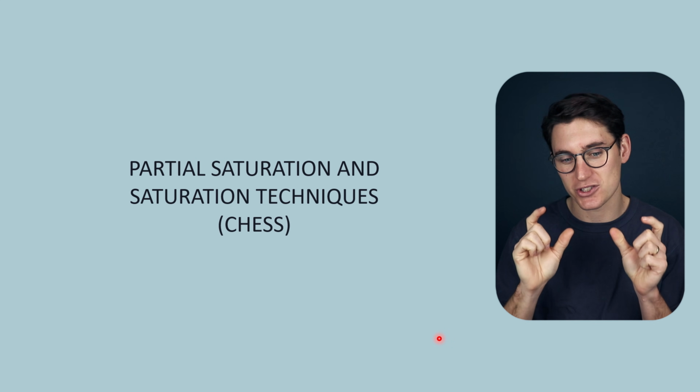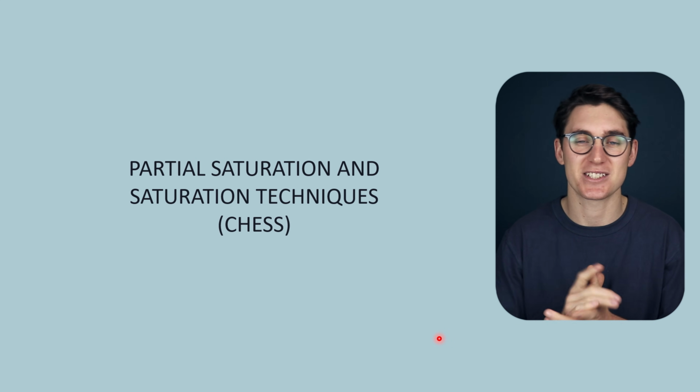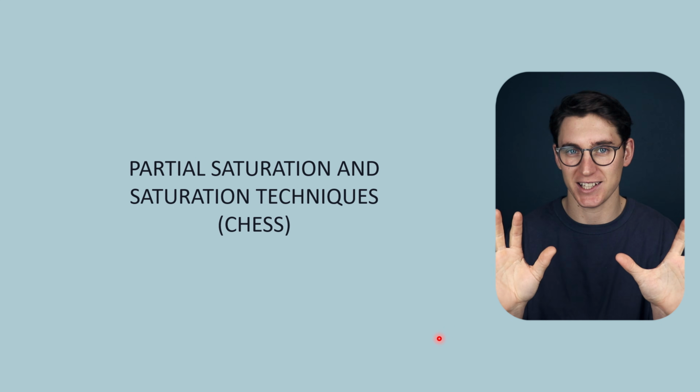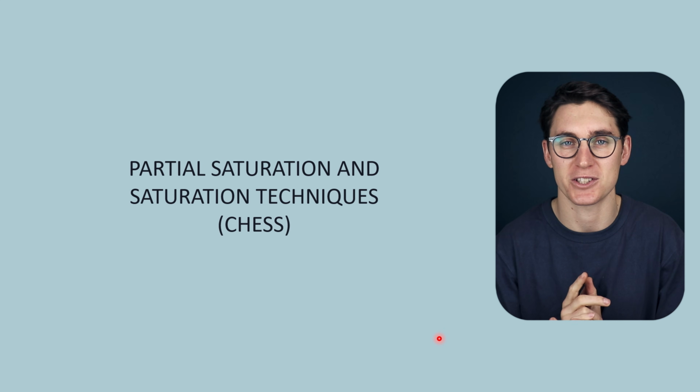Now today I'm going to focus on a specific saturation technique known as CHESS, or chemical shift selective saturation sequences. Now you'll see that I've separated this into partial saturation and saturation techniques, and these are fundamentally different from one another, and we need to know the difference between the two.